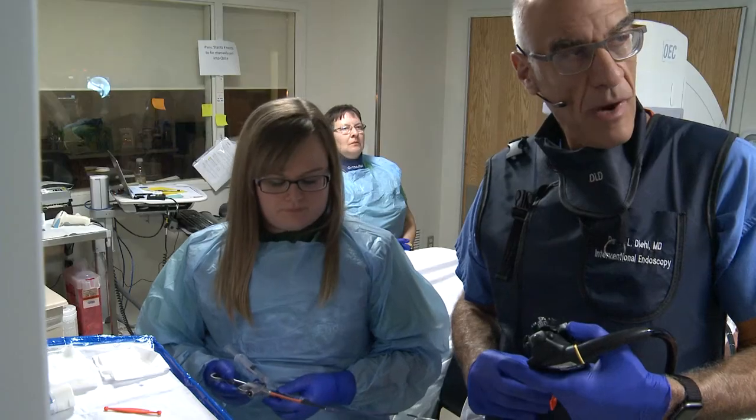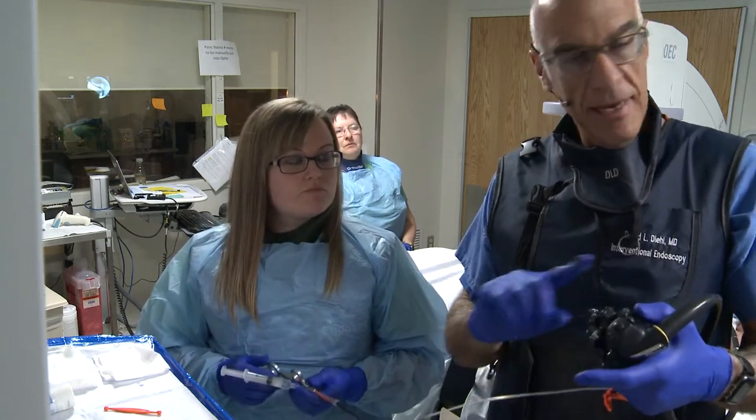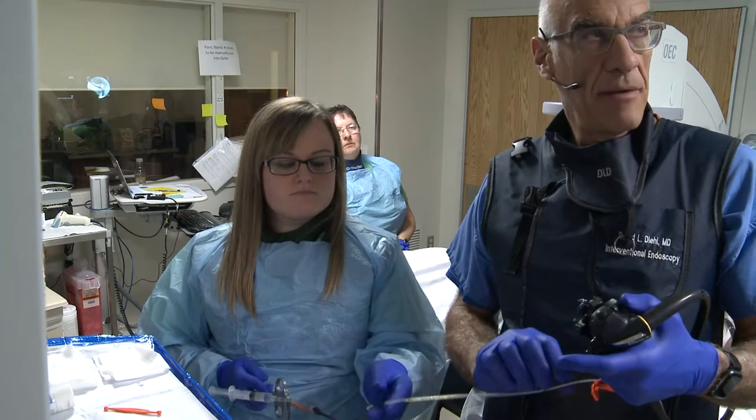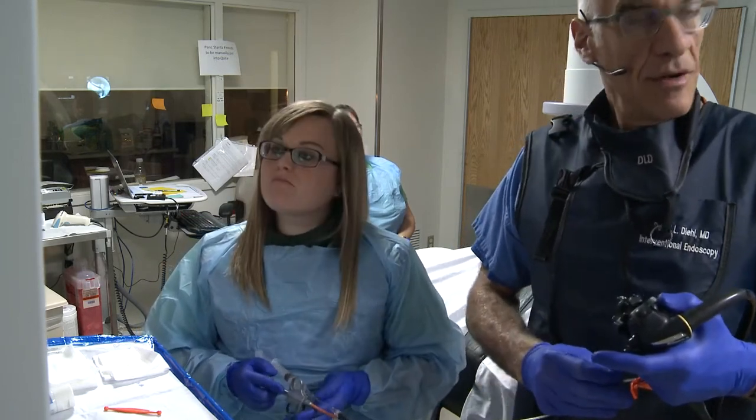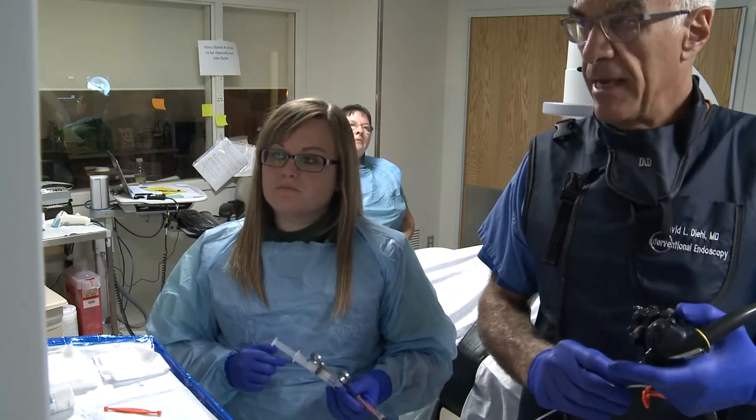So, the angled wire — I was actually spinning it with my hand and turning it, and it turned in the direction of the common hepatic duct and actually found that. A nice case showing the advantage of an angled wire in some cases.